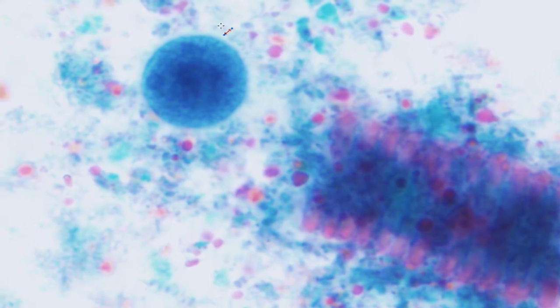Something very important, please: if you cannot make a proper species diagnosis, if it's too difficult because it's a poor specimen or you just can't find enough to make it, call it Entamoeba species. It's much better to report to a doctor Entamoeba species unable to speciate than to report something as histolytica which is not, or almost worse, report something as E. coli or another commensal when it's actually a histolytica, and then the patient isn't treated properly for a histolytica infection.